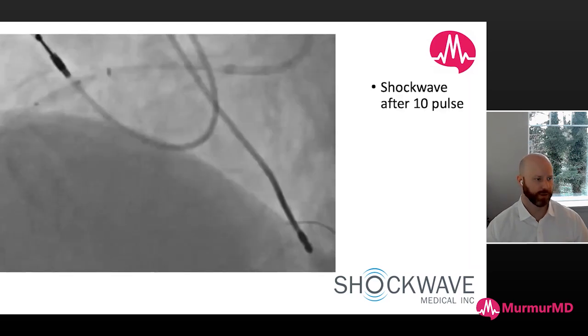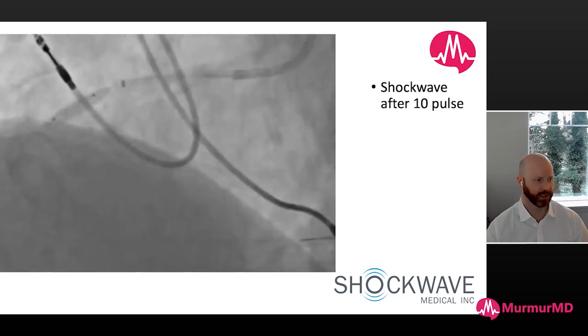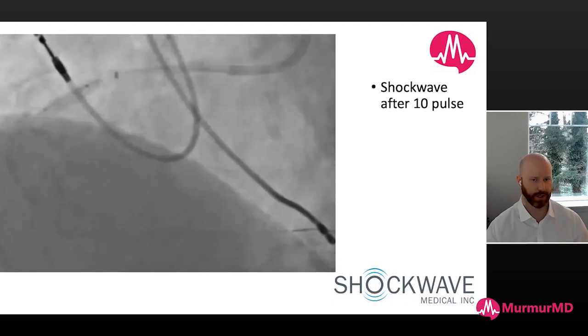We then went ahead with Shockwave intravascular lithotripsy. And you can see here after just 10 pulses, we've completely relieved the calcified circumferential piece of calcium, and we have excellent expansion of our balloon. We went ahead and delivered 30 more pulses along the right coronary.